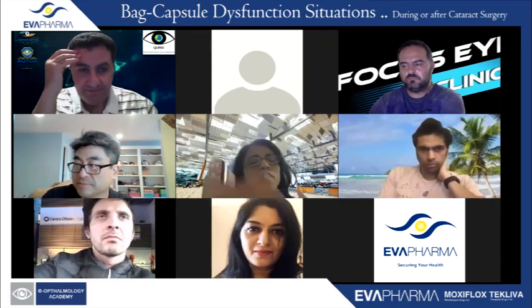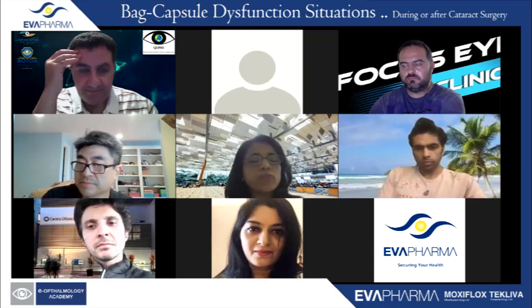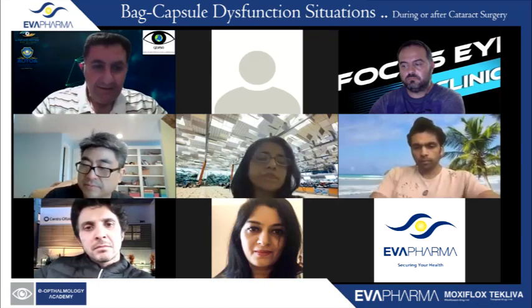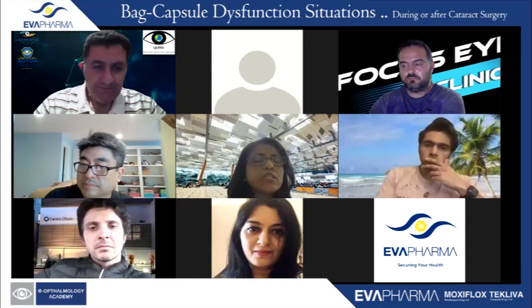In this, in addition, you have an anterior capsular support and a posterior capsular support. So tilt is really not an issue in this surgery at all, unless your sclerotomies are not at the same distance. But it's a little bit anterior than the glued IOL. True? Why would that cause a tilt?